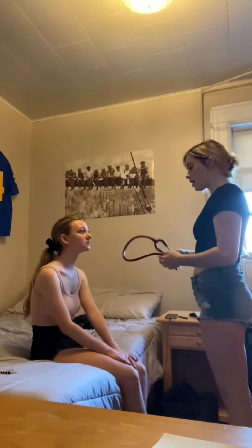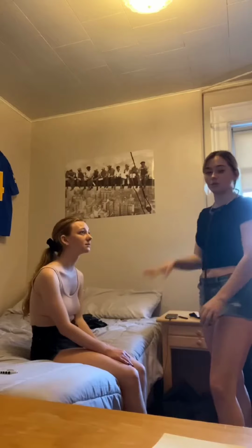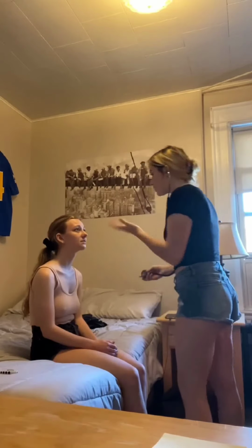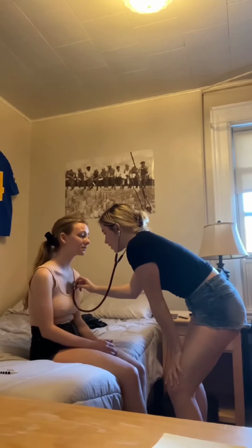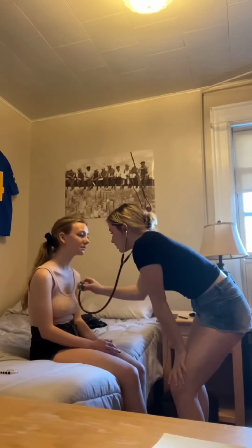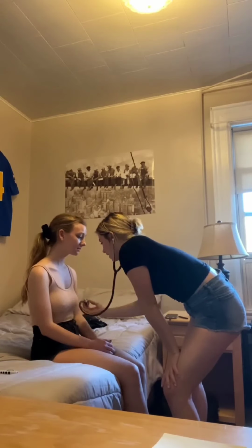Next, I'm going to be moving on to your cardiovascular assessment. In order to do that, I'm just going to listen to your heart. And again, when I took her heart rate the first time, she had a normal rhythm. Nothing was wrong with that when I took her vitals. So if you could just take a deep breath in and out for me. First, I'm going to listen to your aortic. Good. And then your pulmonic. And your tricuspid, and lastly your mitral.